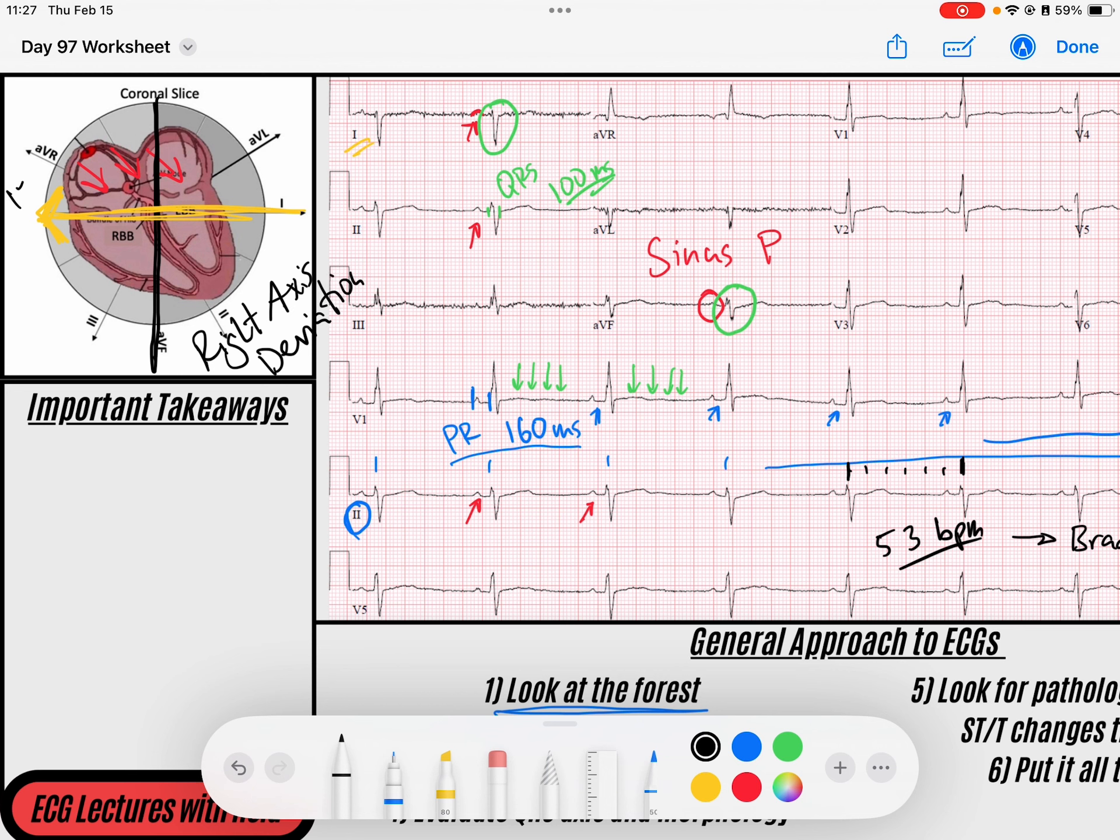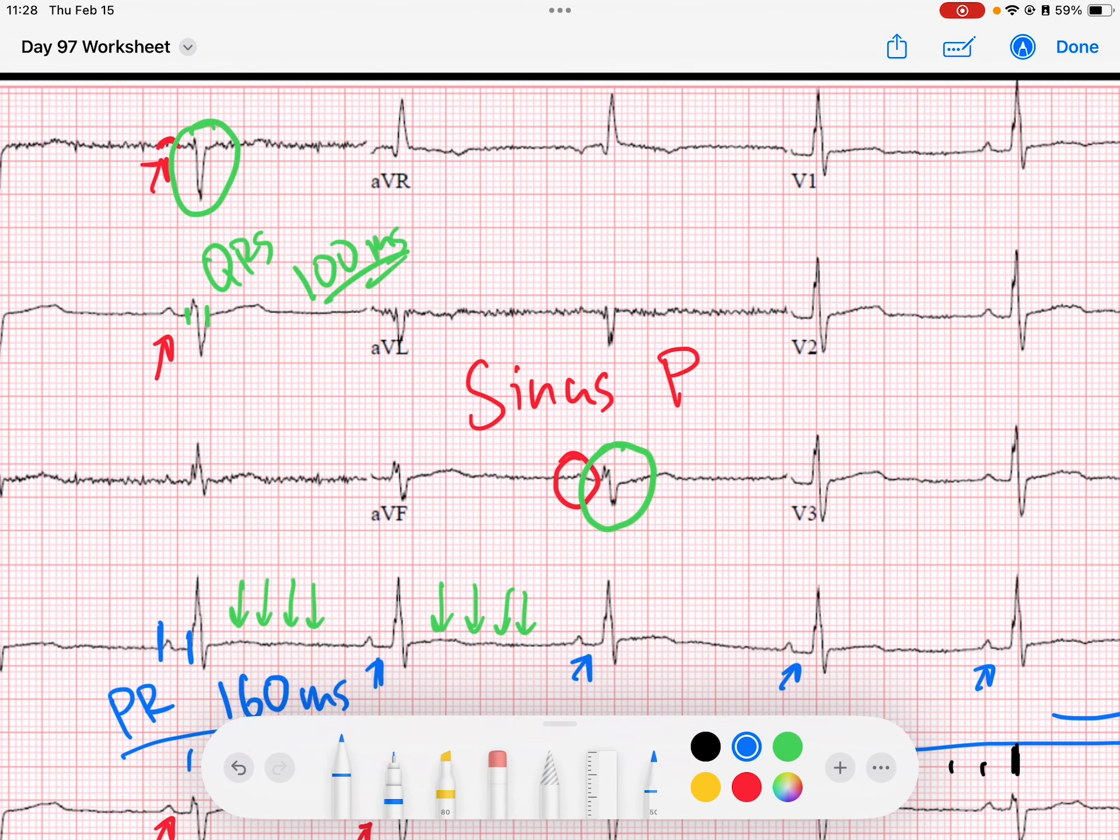So this is right axis deviation, that's 180 degrees. And so what are the causes of right axis deviation? The first thing that's coming to your mind is right ventricular hypertrophy. If this right ventricle was big and strong in a bad way, if it was too big and strong, it's going to pull signal to the right. So I look in V1, which is my lead that mainly captures the right ventricle, and I see I've got these really tall R waves.